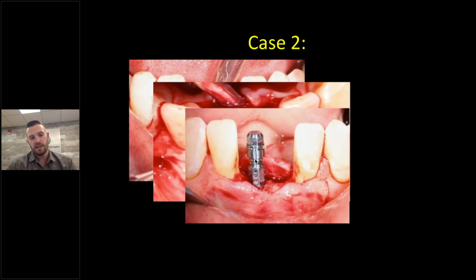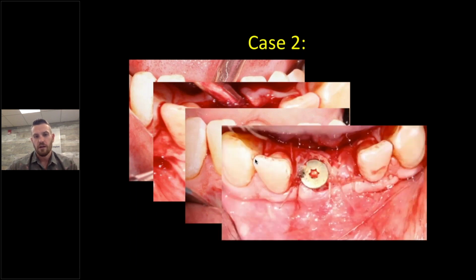And that is with the implant in place, cantilever bridge planned again. Two implants could have been possible. Personally, I don't think that's a very good idea in a space this small. Cleanliness of this implant is very important in its long-term success. So soft tissue is still very, very minimal at this point. So a connective tissue graft was done, and then everything sutured in place with the healing abutment tacking that connective tissue graft down.